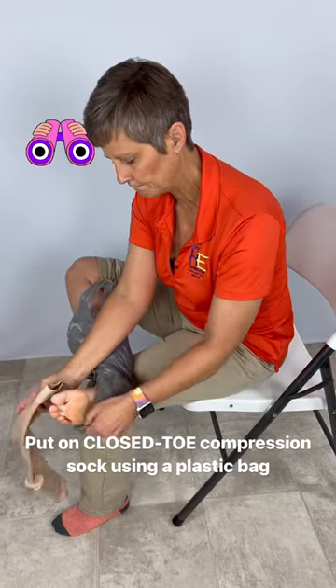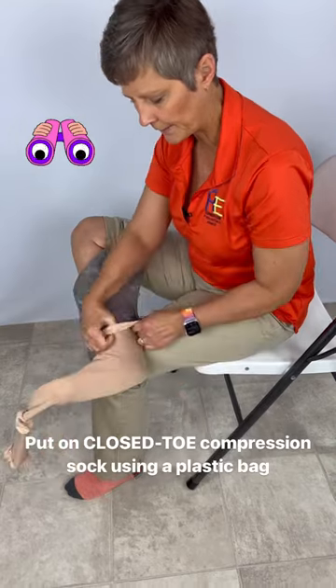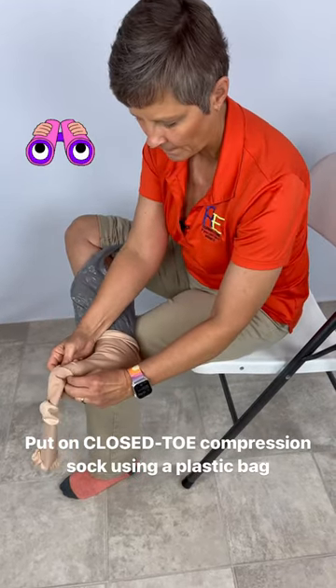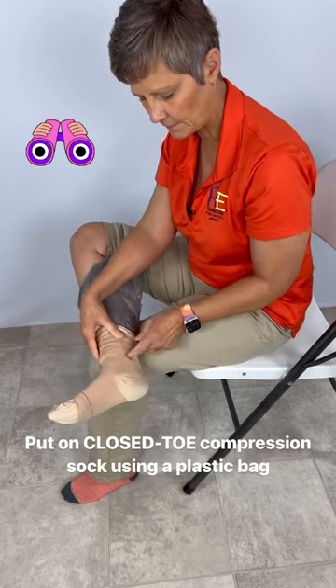I take my stocking, slide it over, and I'm going to get my heel in place here, just like that.